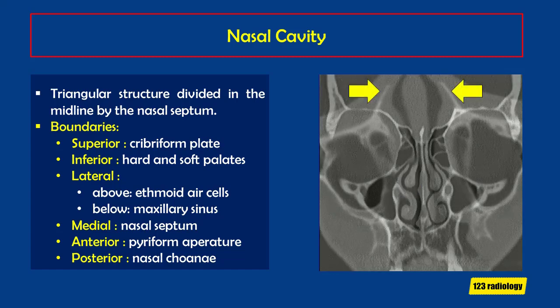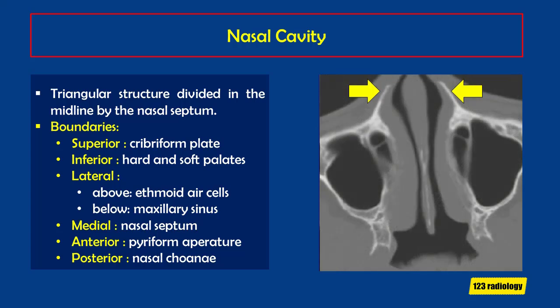If we look at axial images, you can see anteriorly the nose opens up at the piriform aperture. And if you look posteriorly, you can see the choana, which separates the nasal cavity from the nasopharynx.